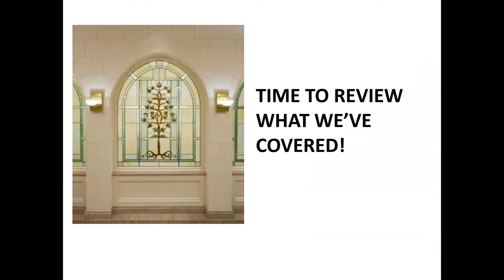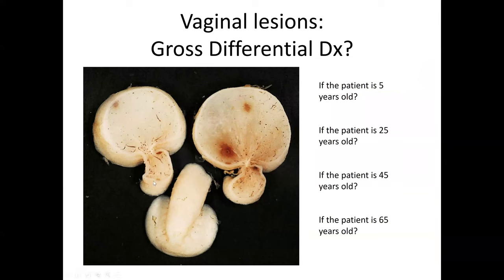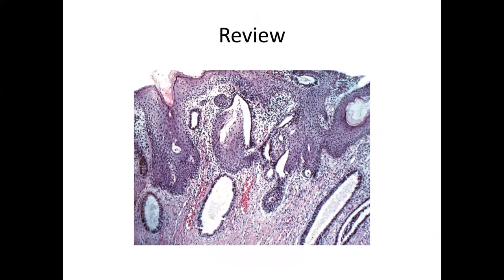In a quick review: a polypoid lesion with a myxoid-type stroma on a stalk illustrates how the same lesion in a child prompts thinking of sarcoma botryoides, in an adult fibroepithelial polyp, and in an older patient possibly a more concerning adult-type lesion — so age determines the differential. A low-power image with squamous epithelium and intermixed benign glandular appearances should make you think of vaginal adenosis.